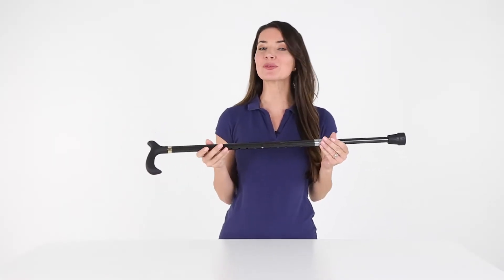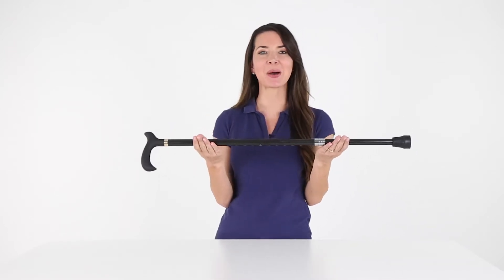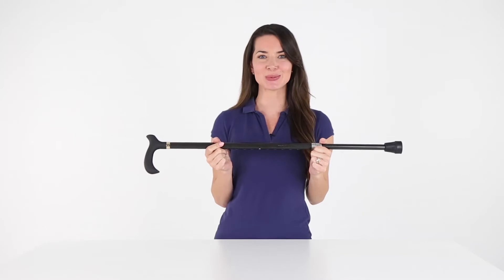Constructed with an ultra-light carbon fiber material, the Vive Carbon Cane weighs less than one pound for comfortable daily use.